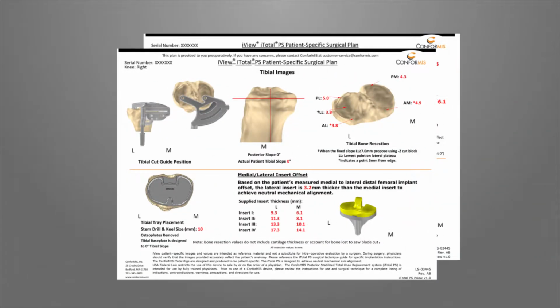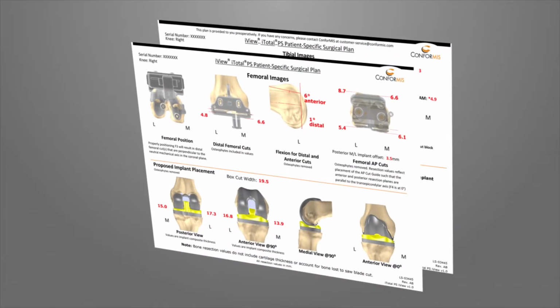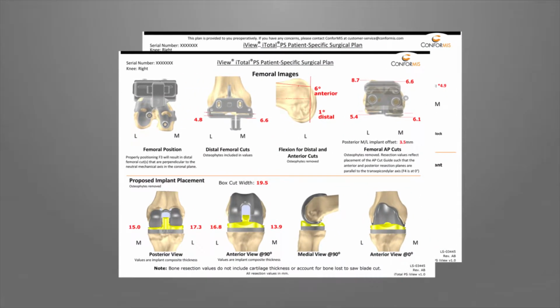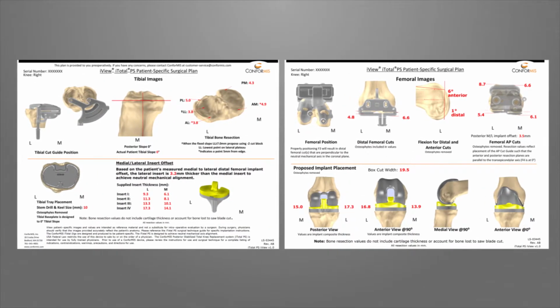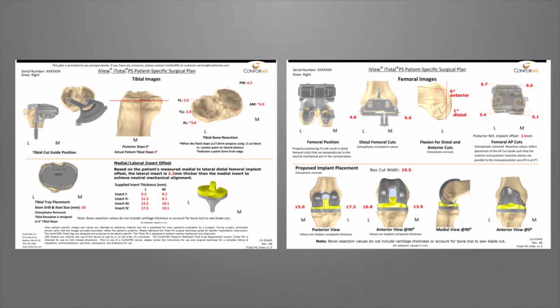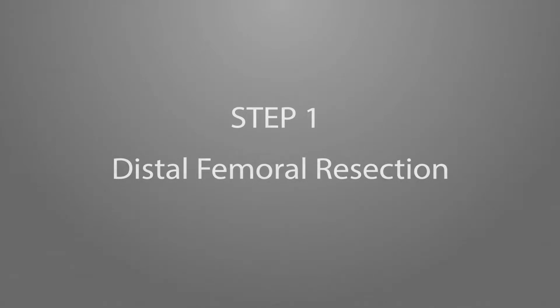Every iTotal PS system ships with a set of iView patient-specific planning images. The iView images provide patient-specific information on bone resection and distal femoral implant offset values, as well as positioning information for the implants and iJigs. Step 1. Distal femoral resection.